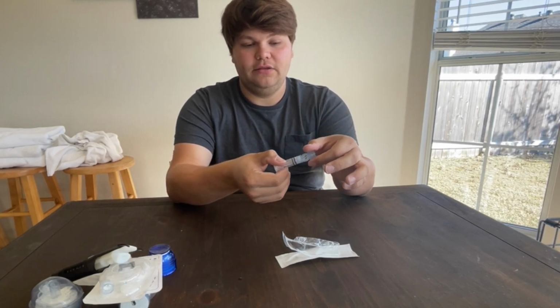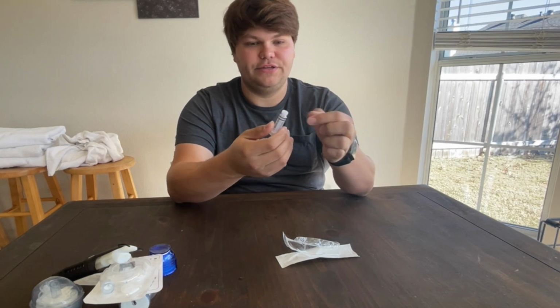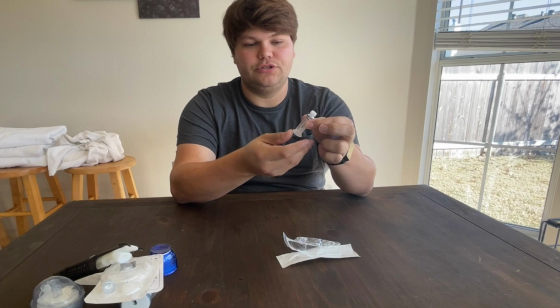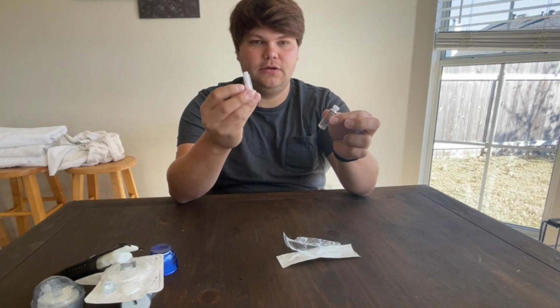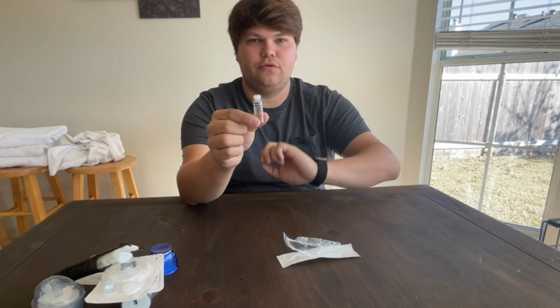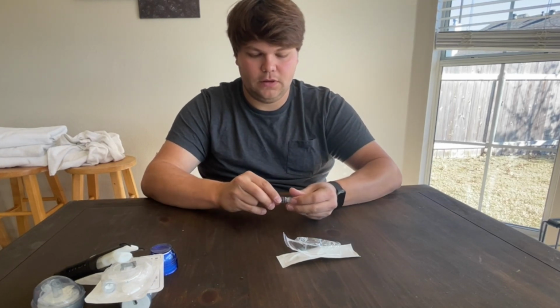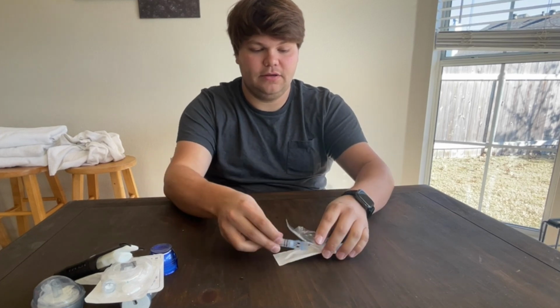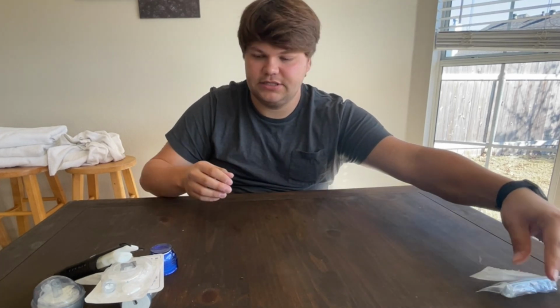When you're done, you twist and pop the reservoir cartridge off. When it's pulled all the way back, you'll twist and pull out the handle for the plunger, and then you'll attach the reservoir to your infusion set, which we'll talk about shortly. Let me put that back together, slide it in there, and place it over here to the side.